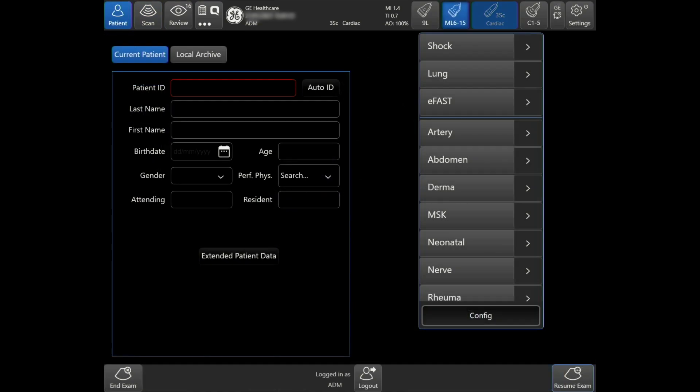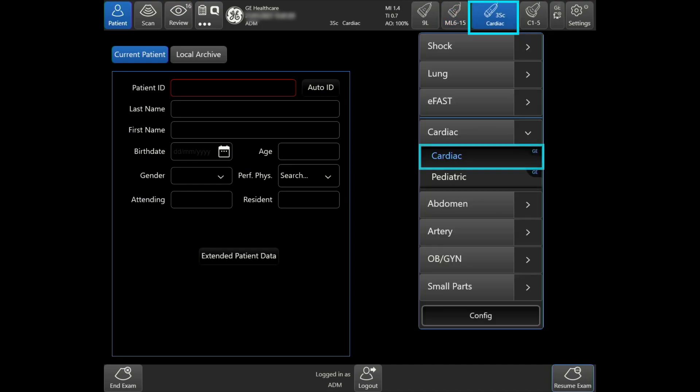Select the desired probe and preset from the patient page. In this case, I'll select the 3SCRS probe and the cardiac preset.